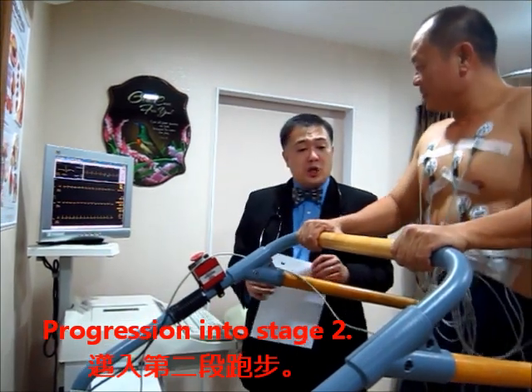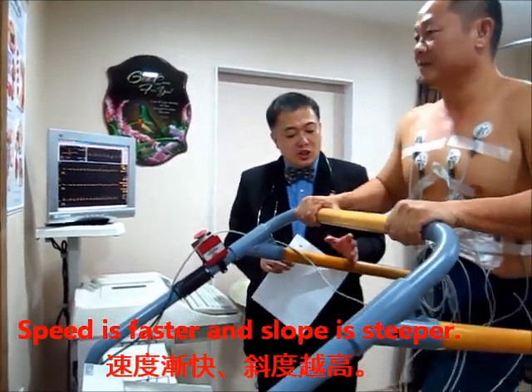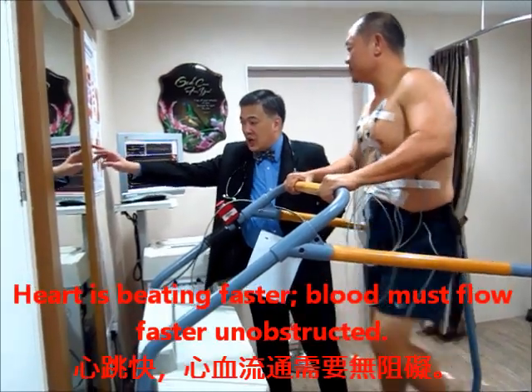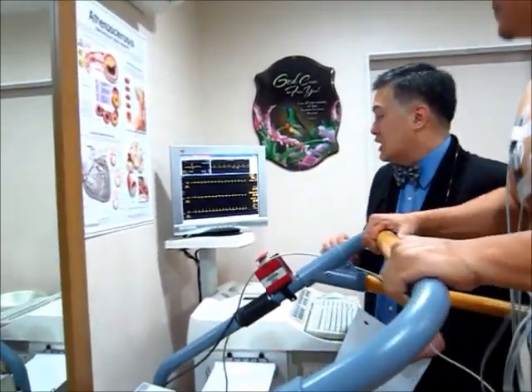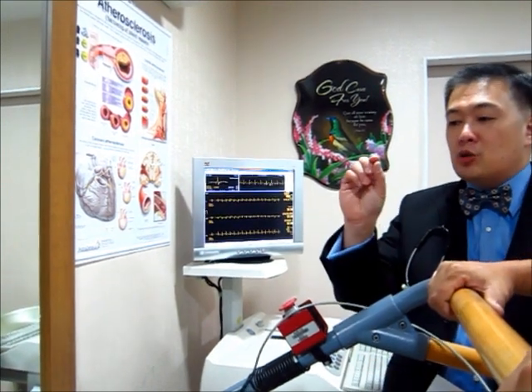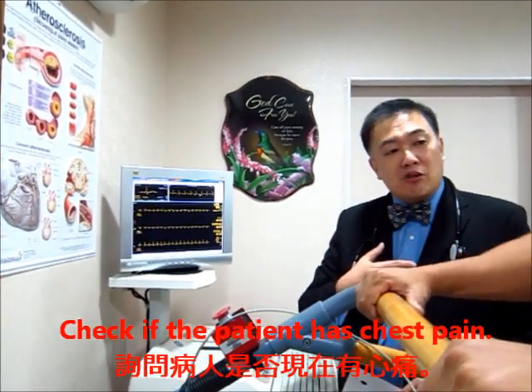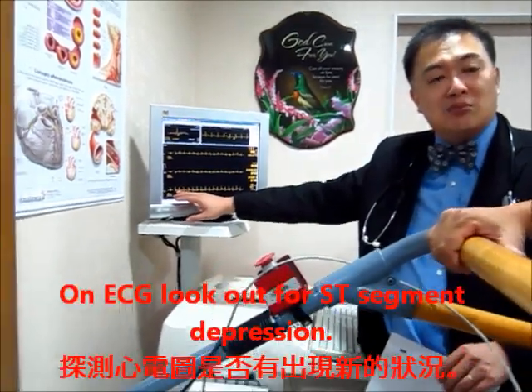Mr. Koh, you've just entered stage 2, which comprises another 3 minutes where the speed has picked up and the inclination has become very steep. You need to put more effort in — you don't need to run, just open your steps and walk faster. As you walk faster your heart will beat faster. Inside your heart, the arteries are very small vessels only 2 to 2.5 millimeters. When the heart beats very fast, blood has to travel through them quickly. If there is any narrowing, like a bottleneck, the blood will find it more difficult to reach the heart muscle. When this happens you may feel tightness or pain in the chest, get breathless, and on the ECG this line will start to sink — what we call ST segment depression.